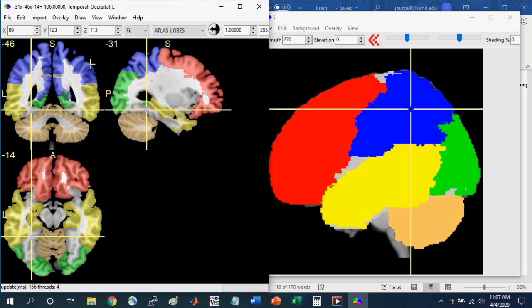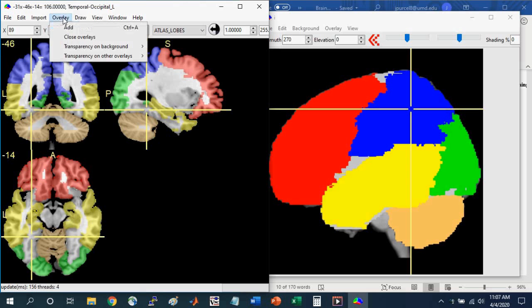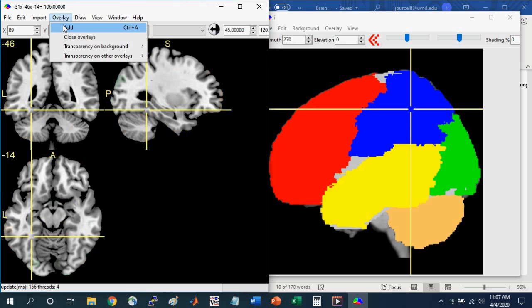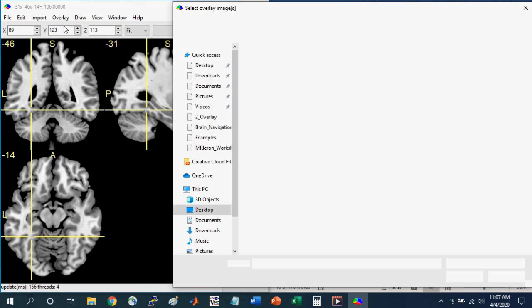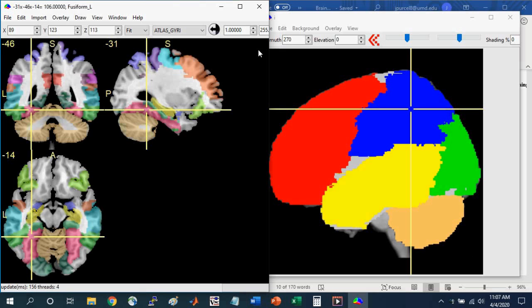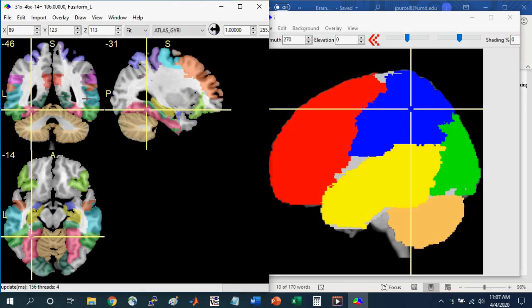Next we can look at a more detailed atlas. To do that, first close the atlas that you have overlayed. So go to Overlay, Close Overlays, and then go to Overlay, Add. And now we're going to select the atlas gyri. Open. And now you'll see much more detail to these structures.